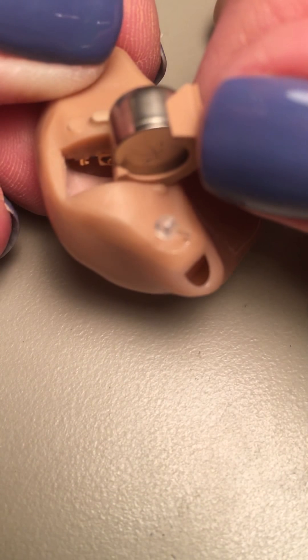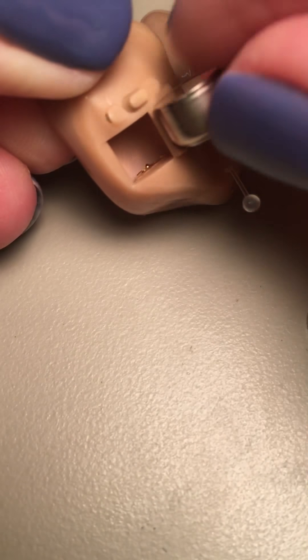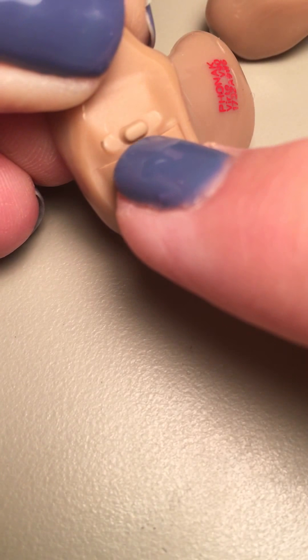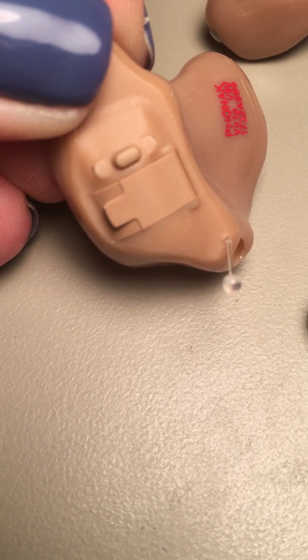If you put it in backward — which is possible, but it's not easy — it obviously doesn't look nearly as neat and it won't let you shut the door. So if you put it in correctly, it should let you shut the door very easily. To turn it on, all you have to do is shut the battery door; it turns itself on and should be ready to go.